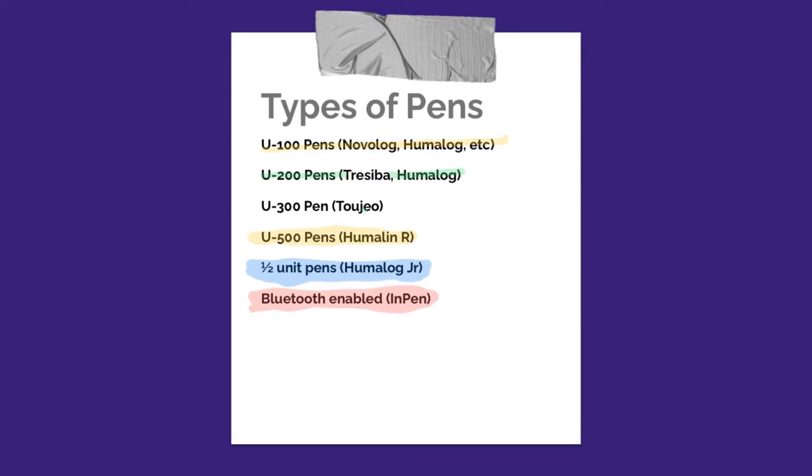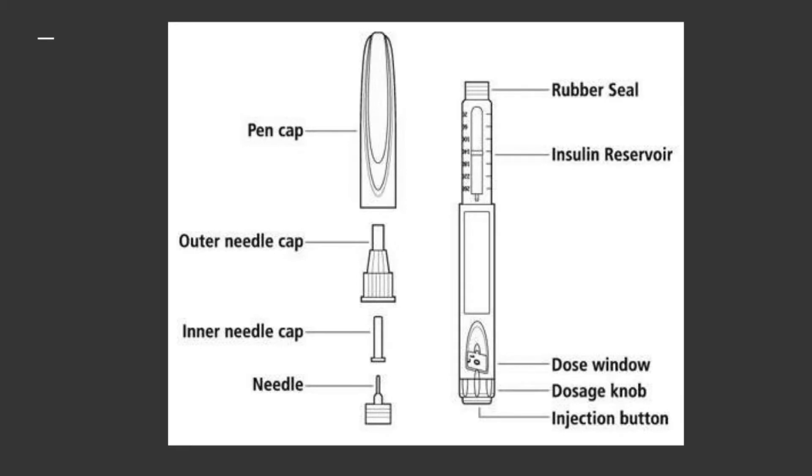These Bluetooth pens give you that extra tech aspect that you would get with an insulin pump, but you still get to use your pens. Pretty much all of the pens are going to have the same parts. They may be different colors and have a slightly different feel to the clicking, but once you know how to use one type of pen, you know how to use them all. They are pre-filled with insulin — typically about 300 units — and you can see in the reservoir how much insulin you have. There's a little window that allows you to see what dose you're dialing up, and then the little knob and injection button are on the end.